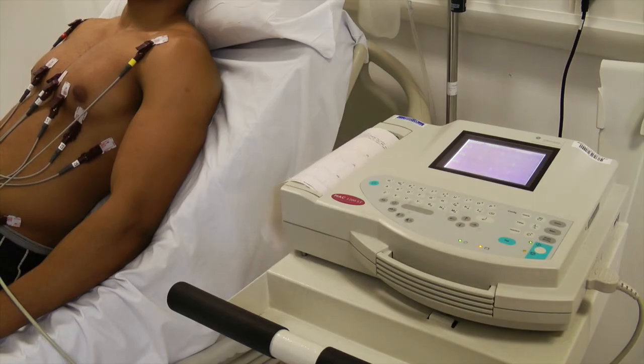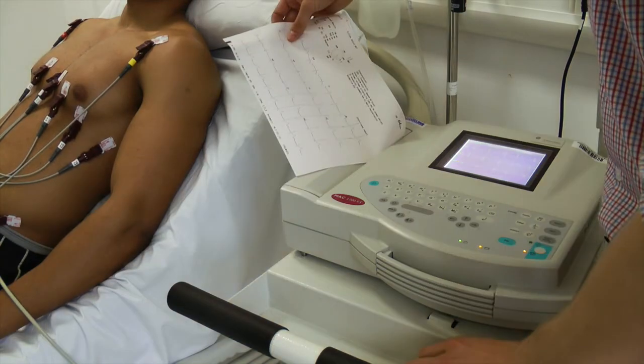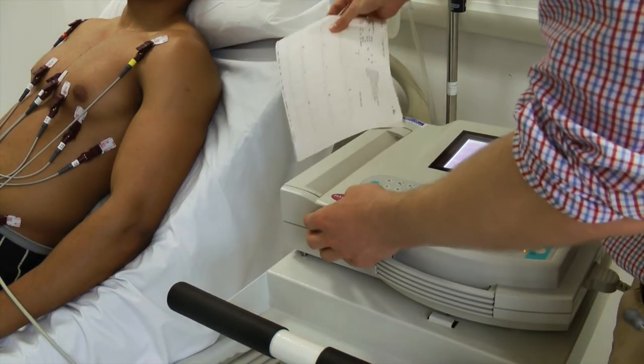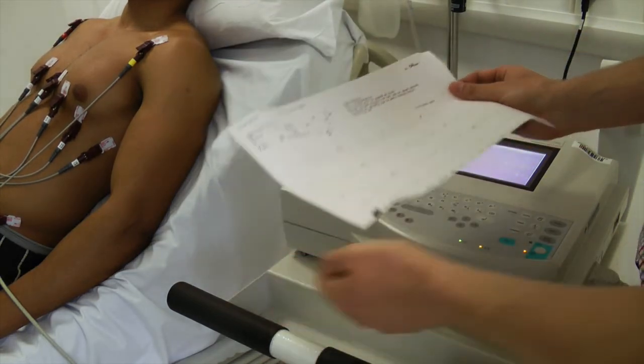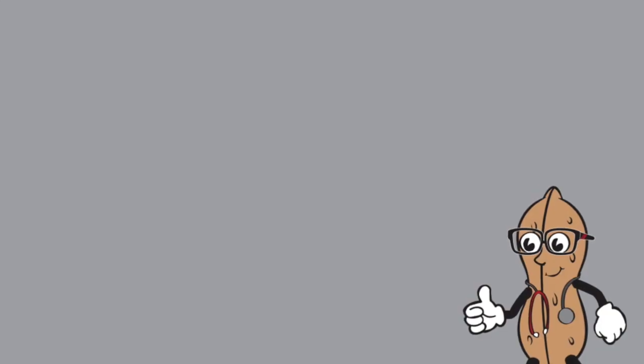Once the ECG is complete, let the patient know and analyse the ECG. Do not remove the stickers until you are happy with the ECG you've got. Label the time and date on the ECG along with any clinical details such as chest pain.